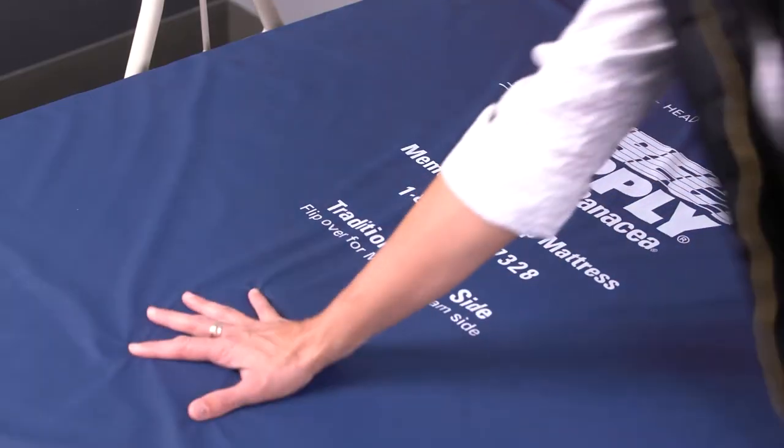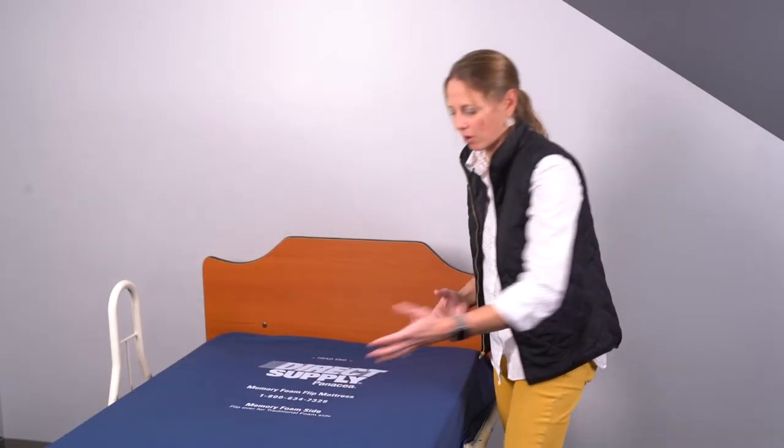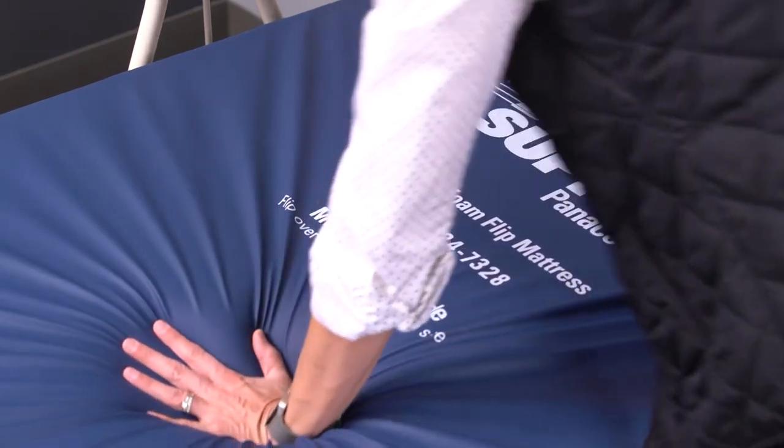Just like our customer favorite, the Panacea Flip Mattress, this mattress has two firmnesses. On one side we have traditional polyurethane foam which is going to spring back instantly. On the other side we use viscoelastic foam, which is a slow recovery foam that's really good at redistributing pressure.